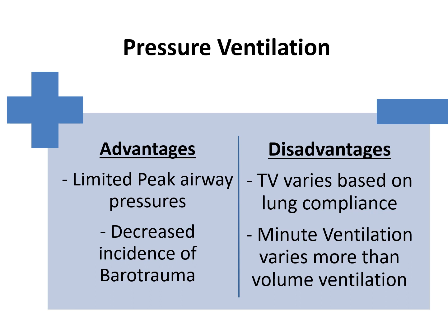And just to give you an idea, again, the minute ventilation is the tidal volume times the respiratory rate. Usually your tidal volume is about 500 times, let's say, 12 breaths per minute. That equals 6,000 milliliters a minute. Increasing the respiratory rate or tidal volume will increase your minute ventilation, and this will directly affect how much CO2 is being blown off, or how much CO2 is being retained.